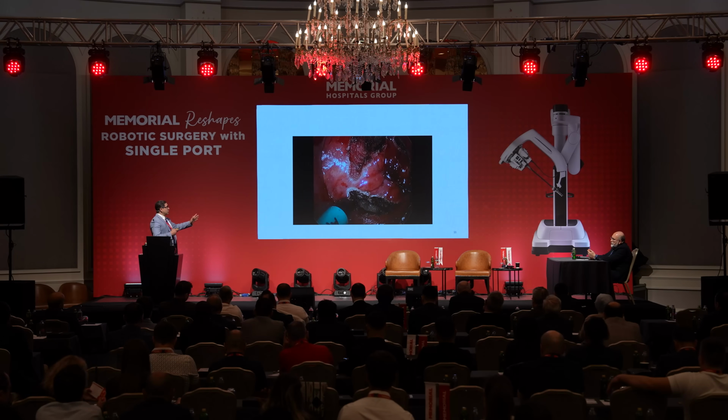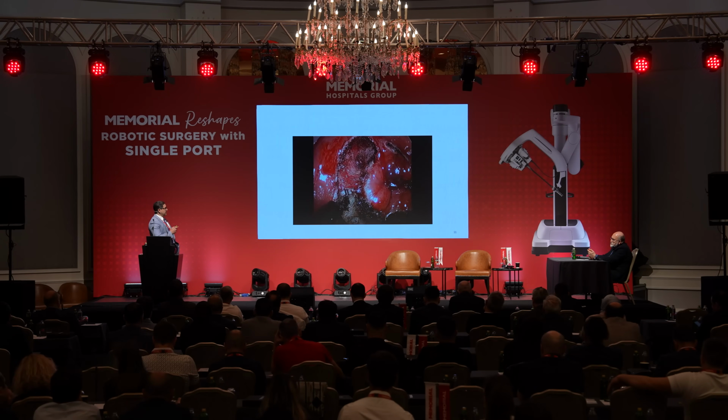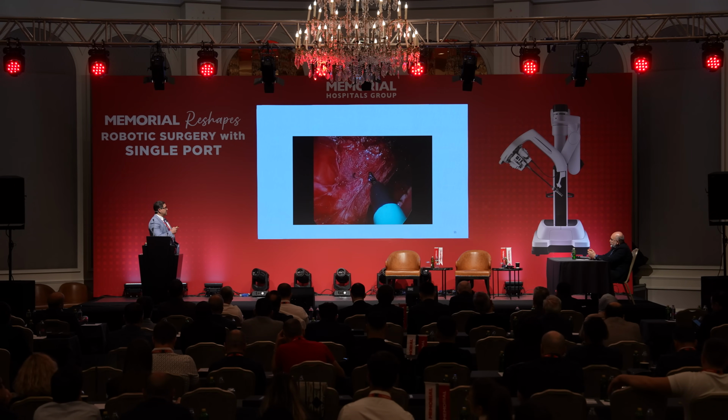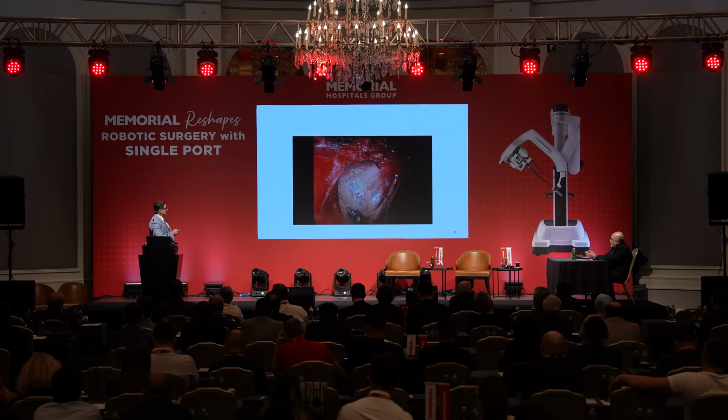So here, as you can see, I already placed the occlusive rectal purse-string suture, and I'm doing the proctotomy. I do it in layers: mucosa, submucosa, muscularis, and then I enter the plane. This is posterior, and I am getting into the TME plane.